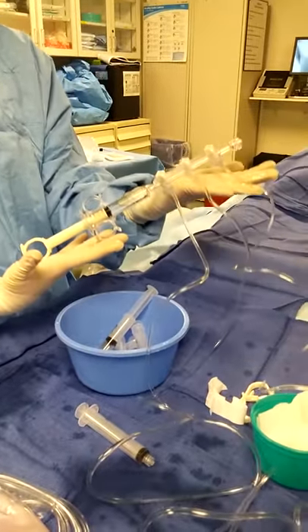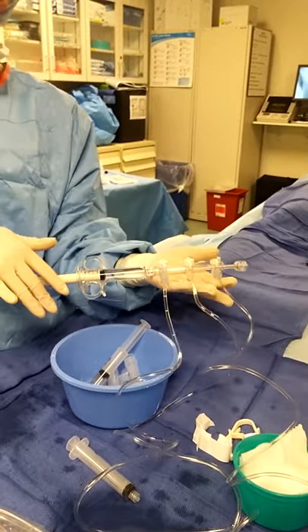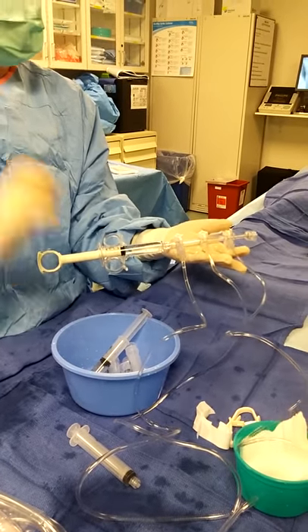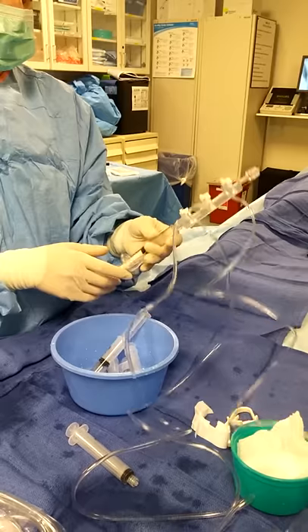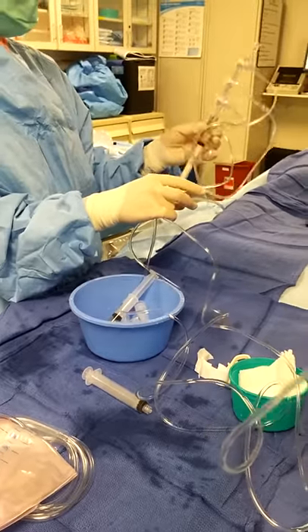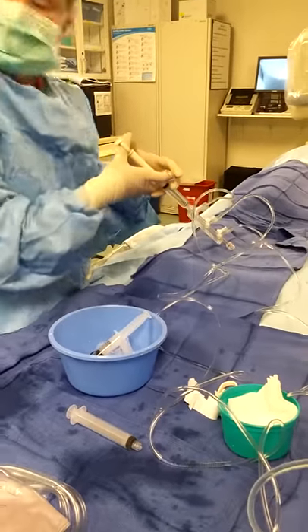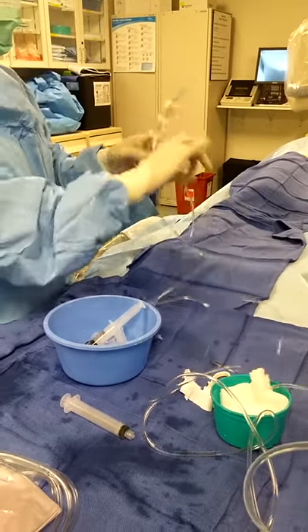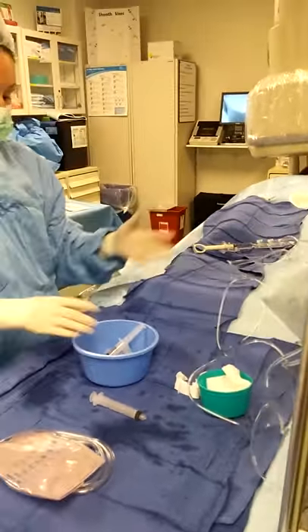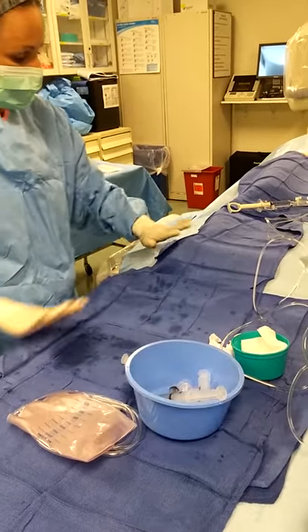So this is a perfect manifold — fluid-filled, air-free. You're going to have your own little fancy twists on this, but the theory remains the same: air-free, fluid-filled. I always leave 7 to 8 cc's of heparinized saline in the control syringe. The reason it's a control syringe is this is what he's going to have to push through to inject the coronaries. Set it nice and gently on the lap, not yanking on any wires. Now you're ready to put your vascular tools up here, flush your equipment, and make everything nice and neat and tidy.